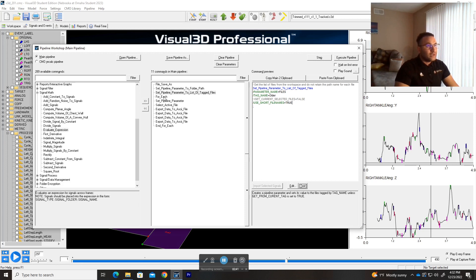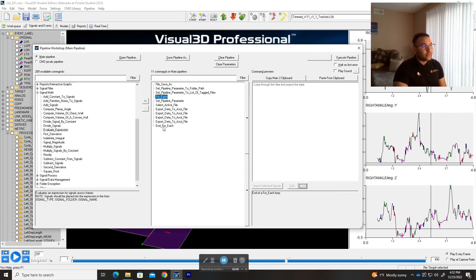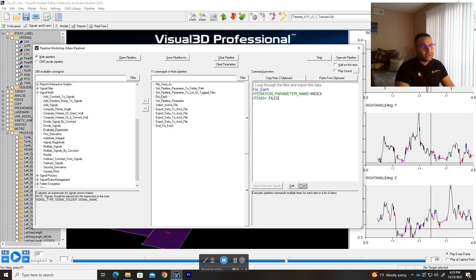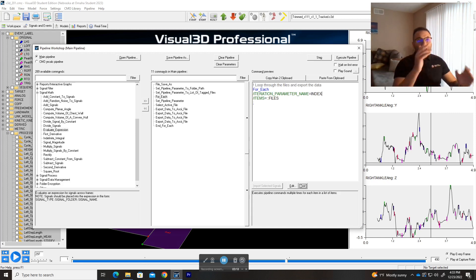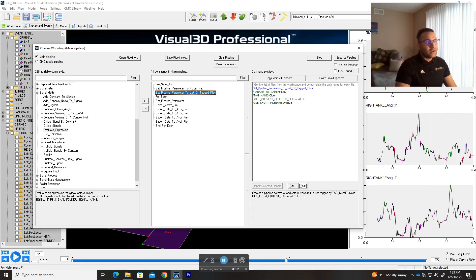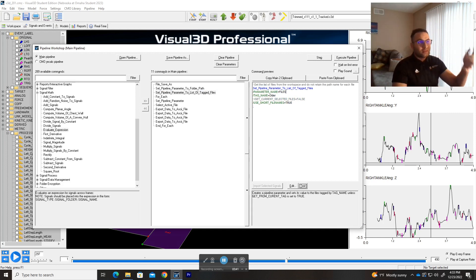Then we start the for loop. The for loop starts with 'for each' and ends with 'end for each' — similar to MATLAB's 'for' and 'end'. For each will loop through the files. The iteration parameter name is 'index' — you can name it anything. We're calling '::files', which calls each file within that tag: the first trial, then second trial, then third trial within the 'older' tag.